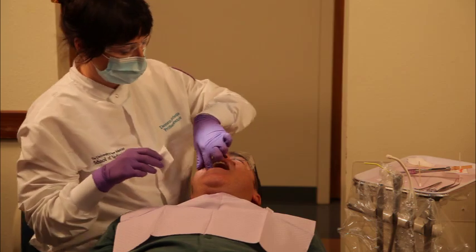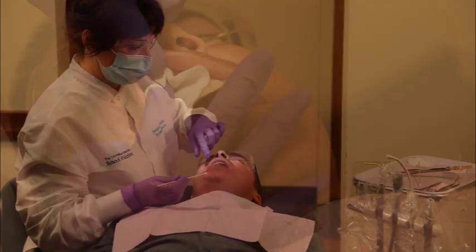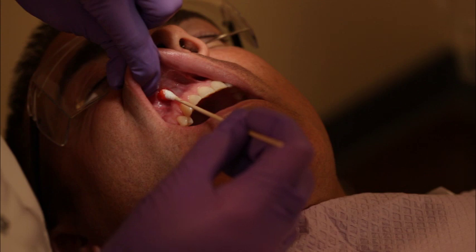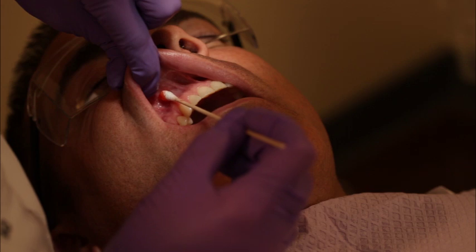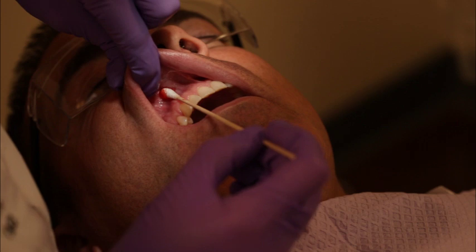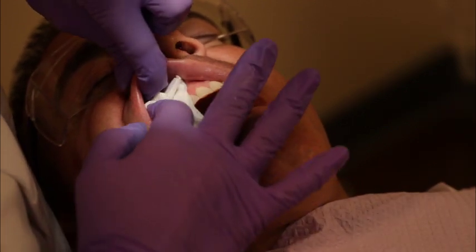Dry the needle penetration site and prepare the alveolar mucosal tissue with topical anesthetic in the vestibule at the height of the mucobuccal fold superior to the apex of the maxillary canine, just anterior to and parallel with the canine eminence. Topical anesthetics are most effective for patient comfort when applied for 1 to 2 minutes. Dry the tissue to remove any excess topical anesthetic.